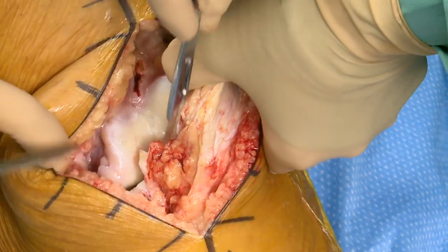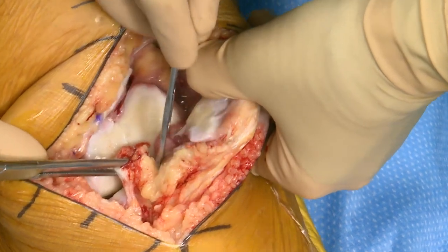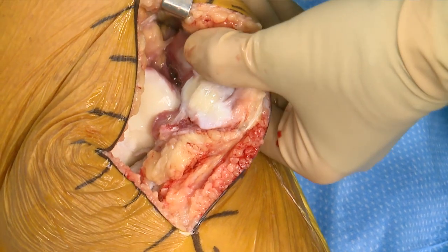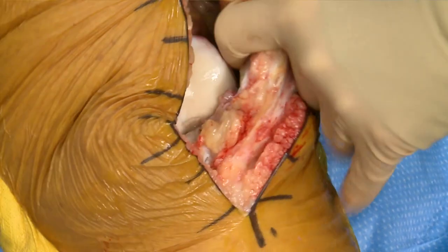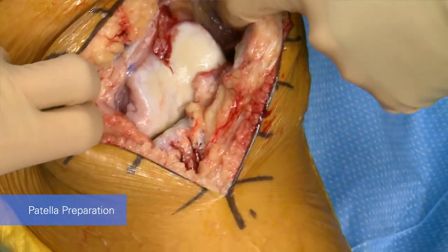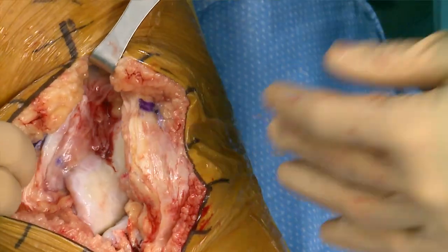Hopefully Dr. Christie's not in the room, but I do take some of the fat pad. I know — I'm conflicted. I take out some of it and I leave some of it, so I'm kind of in between, hedging my bets. I make a little pocket for one of the retractors and then I cut the patella first to help get it out of the way.